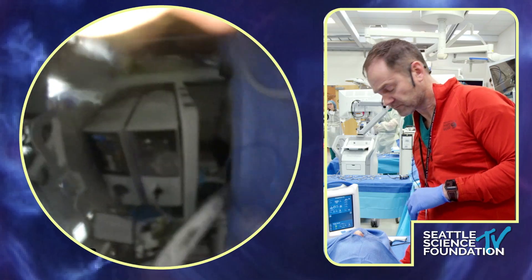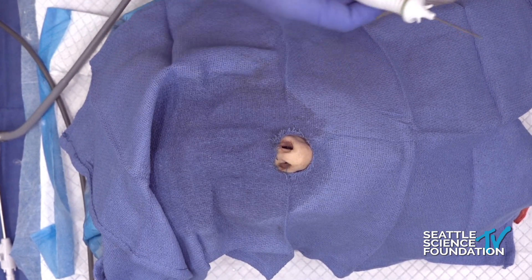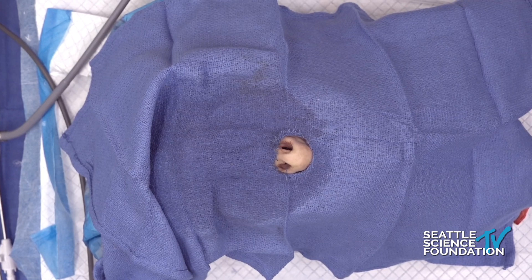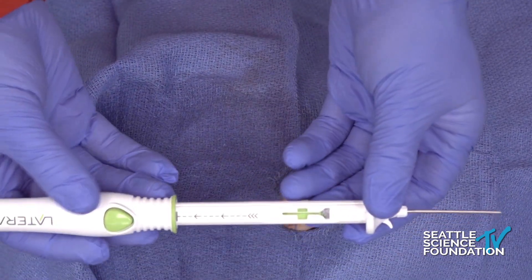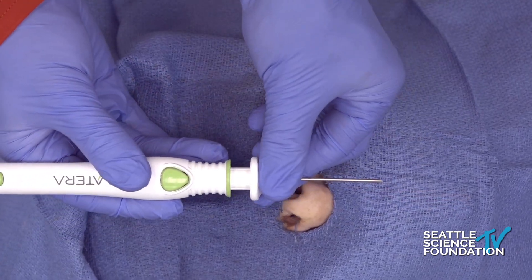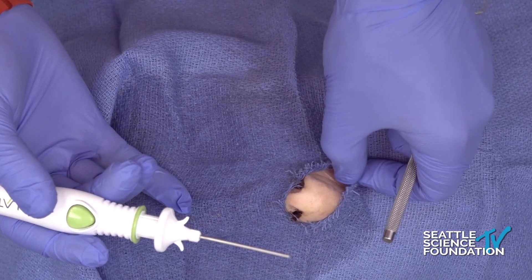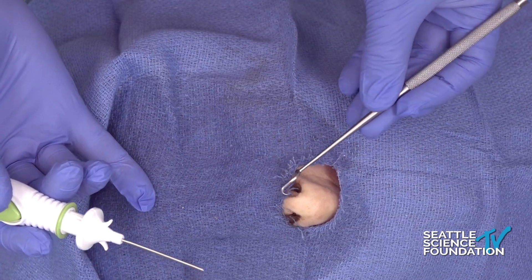The last thing: if you haven't used the Latera implants, this is a really neat device. The hardest part of the procedure is loading it. Slide it down until it clicks. There are two different sizes: a 20 millimeter and a 24 millimeter. The vast majority of my patients get the 20 millimeter. It's really nice to have a double-prong sharp skin hook.